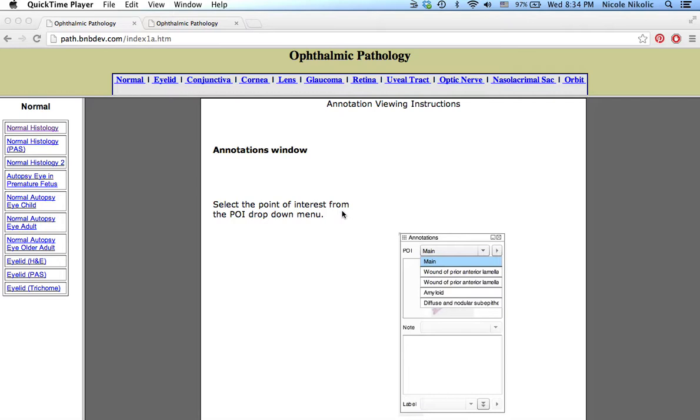Institute. Our website is a collection of high-quality ophthalmic pathology slides that were converted into digital images while using image viewing software to create a virtual simulation of light microscopy, with the overall purpose of fostering self-directed learning of pathologies.